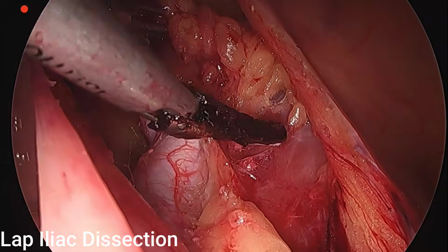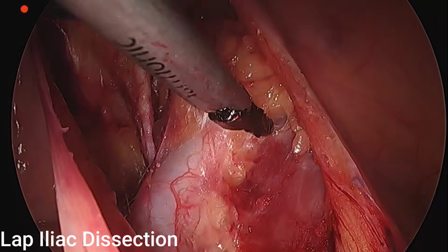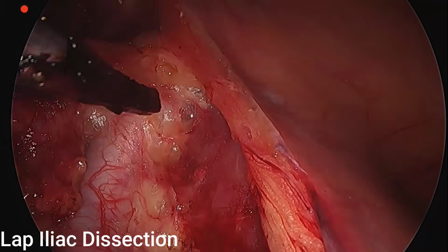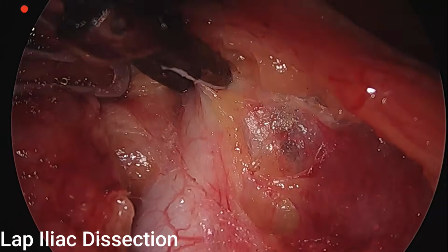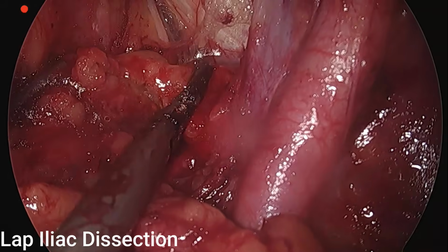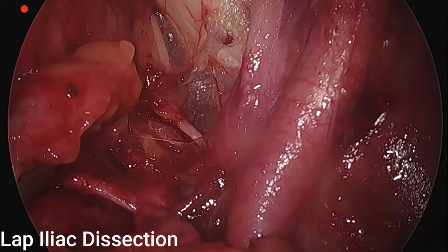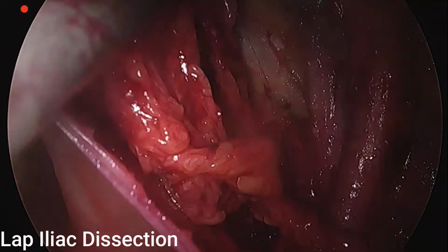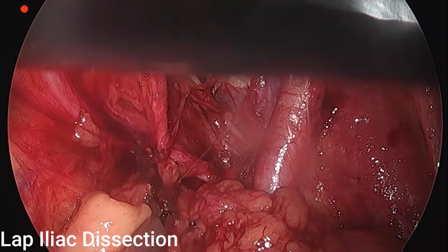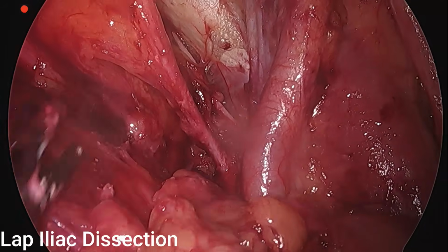Once this is done, a standard pelvic node dissection is begun from the external iliac artery, respecting all the boundaries, that is the genitofemoral nerve laterally, the deep circumflex iliac vein distally, and the common iliac proximally. You can see all the nodes from the obturator fossa removed, along with preserving the obturator nerve, and the pubic bone is completely exposed. This is the last step, and the specimen is kept in an endobag and it is extracted via the 10 mm port by expanding the 10 mm port, and the ports are closed.